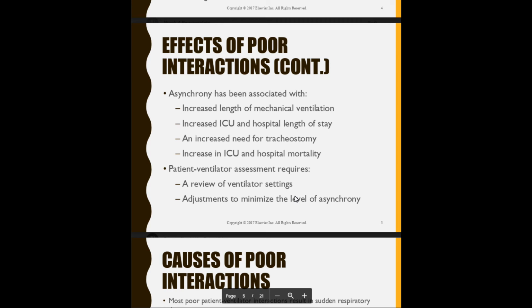Okay, increased ICU and hospital length of stay. And that's just the thing. Remember, we programmed it and we caused it, and we're not identifying it. So therefore, patients' ventilatory needs are not being met. So every time we do a blood gas, that PaCO2 is still going to be high. And so we're going to wonder what's going on, but then the doctor's just going to sit there and say, okay, well, let's just keep the patient for one more day. So we'll continuously monitor the patient, which will increase their length of stay.